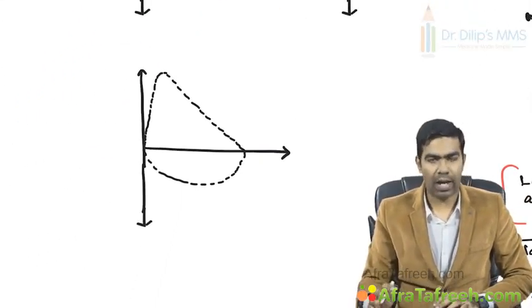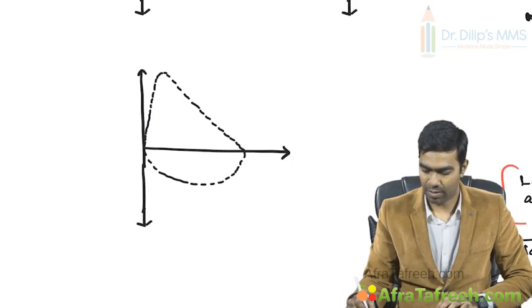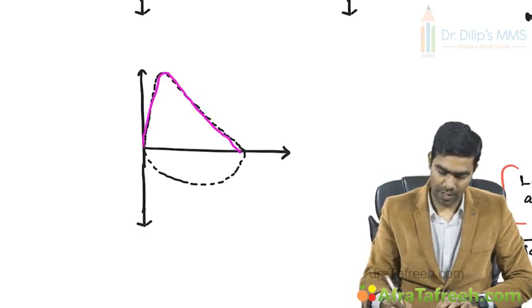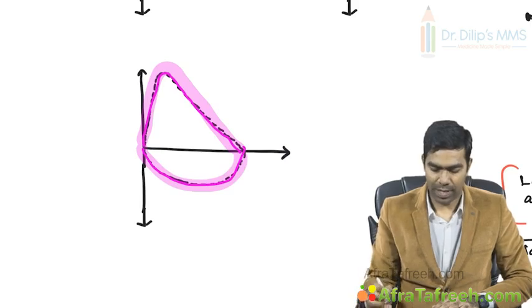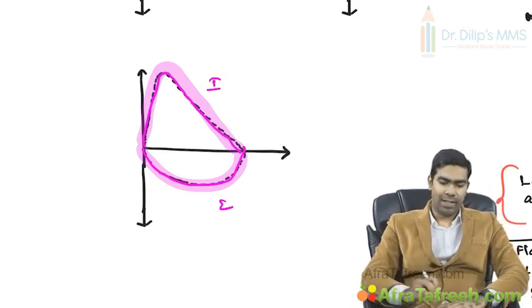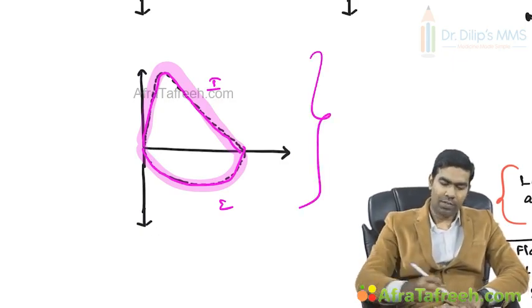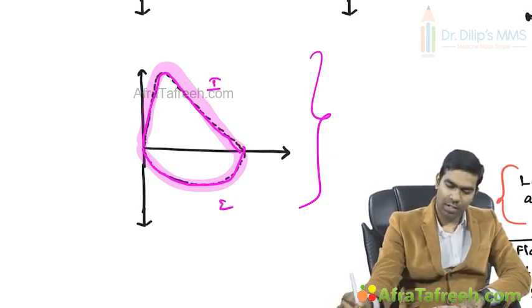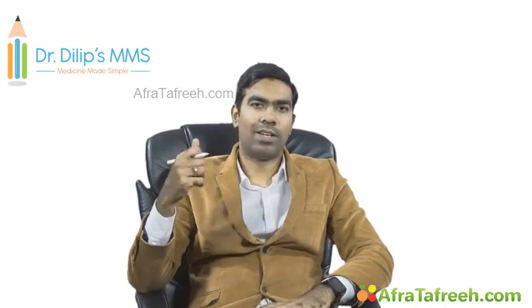But as a final say, you might ask me why I've drawn this. Now everything is normal. I'm putting a completely normal curve like this. Everything is perfectly fine. But I am putting here inspiration and here expiration. Wow, what is this? I've just changed the inspiratory and expiratory limbs. If you see this kind of curve, this indicates the patient is on positive pressure ventilation, that is, the patient is on a mechanical ventilator. The mechanical ventilator flow volume loops will be inverted.